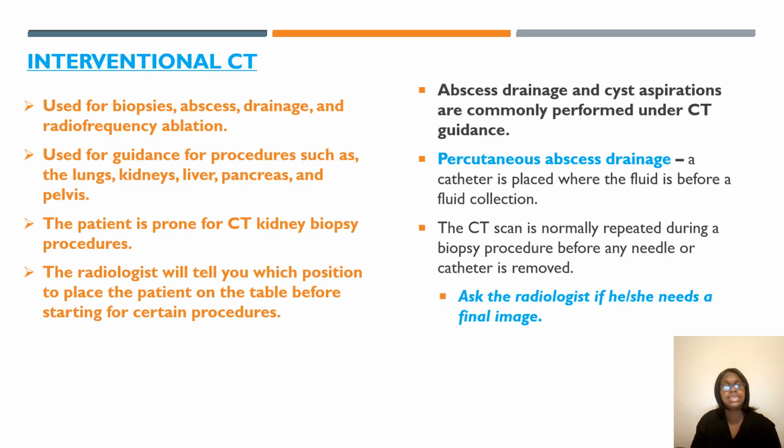For interventional CT, this is when we are going to be performing those biopsies, abscess drainage, and any type of radiofrequency ablation. So this is what this is for. Whenever you do have the patient for a CT biopsy procedure, just check with the radiologist to see how they want you to position the patient. And then before you are done with that biopsy procedure, you do need to ask the radiologist if they need a final picture. Most of the time, they will want a final picture before the needle is removed. So just check with them before taking the patient off the table.